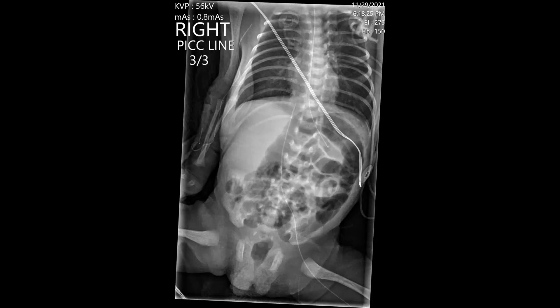On the same patient after adjustment, the catheter from the left lower extremity now takes a very similar course but no longer has the loop, and it terminates nicely at the level of the diaphragm — a nice left lower extremity PICC terminating at the cavoatrial junction. The right upper extremity catheter was not removed and was left in place for emergency access while they were having difficulty with repositioning.